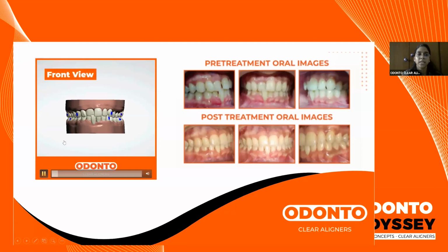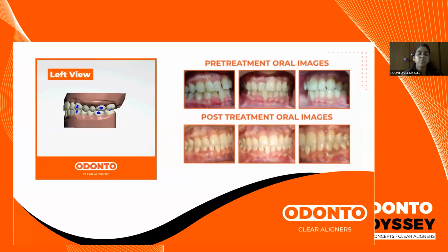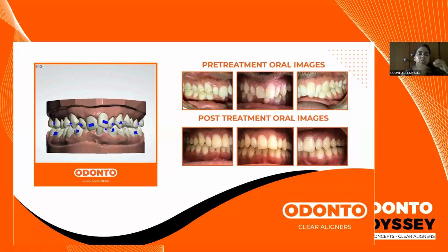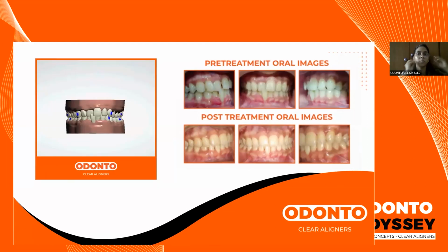Again, something else that needs to be noted in terms of crossbite correction is that we need to place certain bite ramps on the teeth. Now, these bite ramps are for the purpose of disocclusion. They will disocclude the teeth. So there will be ramps on the posterior teeth. What they basically do is open up the bite to allow for the jump in the bite to take place and correct the patient's crossbite. So they're placed on the posterior teeth.